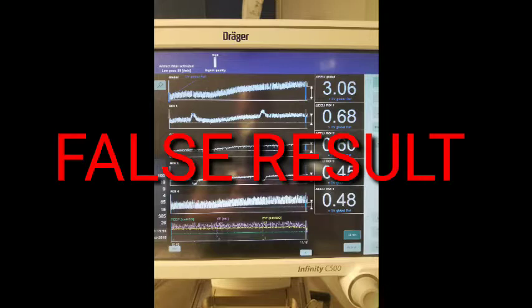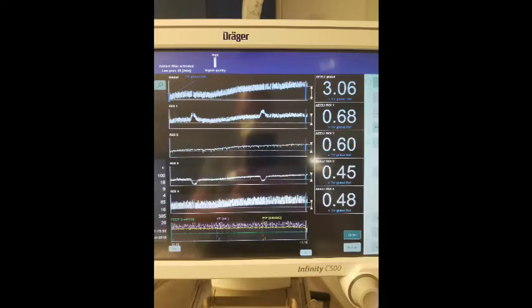What we'll have to do is wait till the patient has been off dialysis and is in a steady state, and then we can redo it and find out exactly what's happening in distribution of ventilation. So guys, remember, watch out when your patient's getting dialyzed, okay? Because if you're doing the study at that point, it's going to look great.